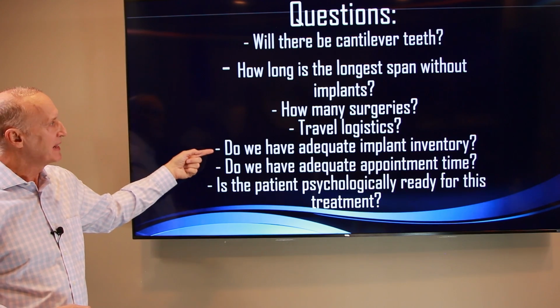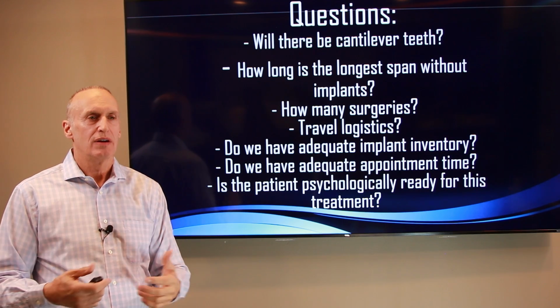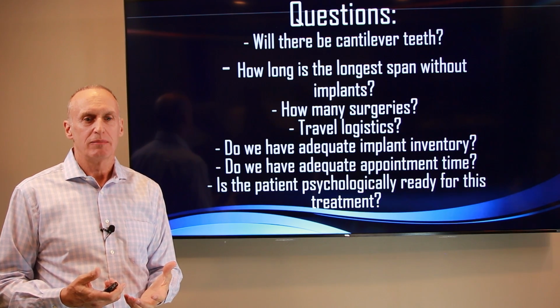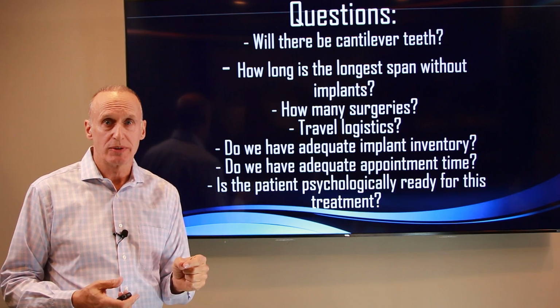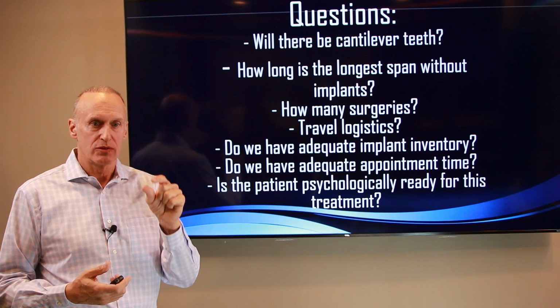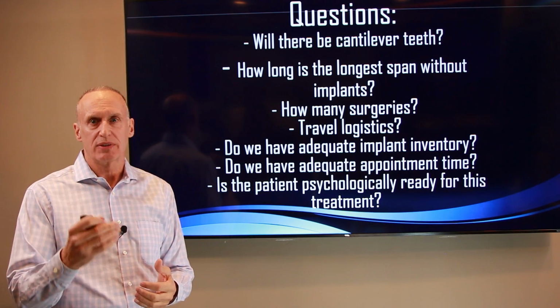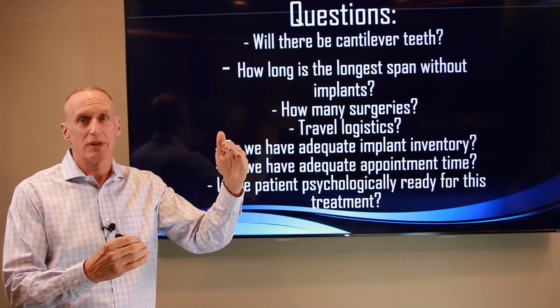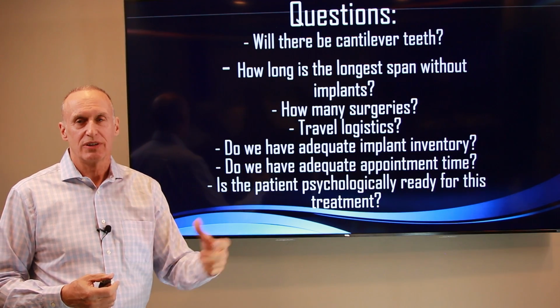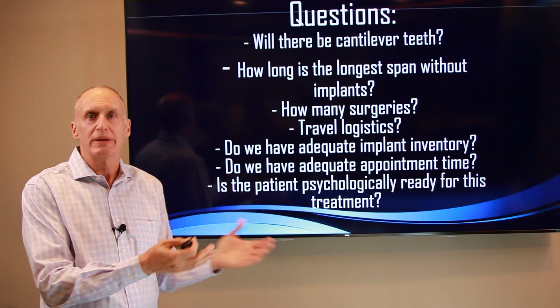Do we have enough dental implant inventory? Because again, no patient's the same in our treatment style. We have to keep hundreds of implants in inventory here. No matter how much diagnosis we do and how many measurements we make, we have to keep hundreds of implants here so that we have the right implant for the tooth position that we're placing the implant into. So the companies make implants from 6 millimeters long all the way up to 22 millimeters long. Diameters range from 3 millimeters up to 6 millimeters. So you can imagine how exponential the inventory has to be to meet all our needs.